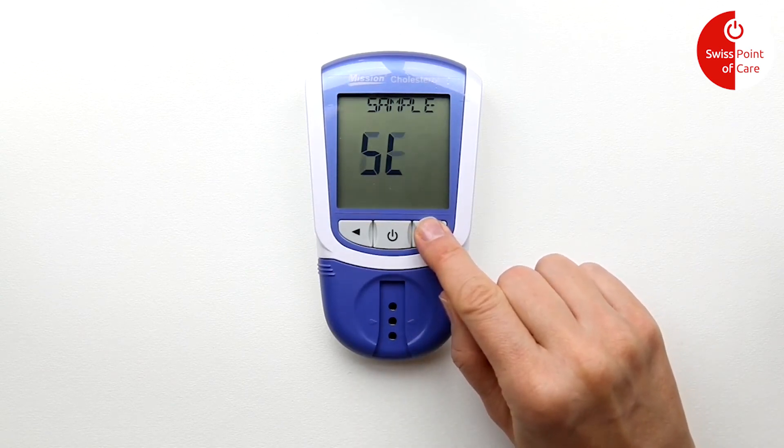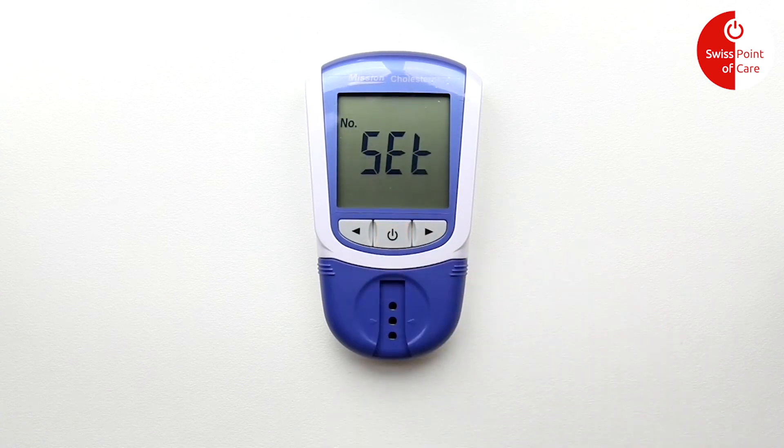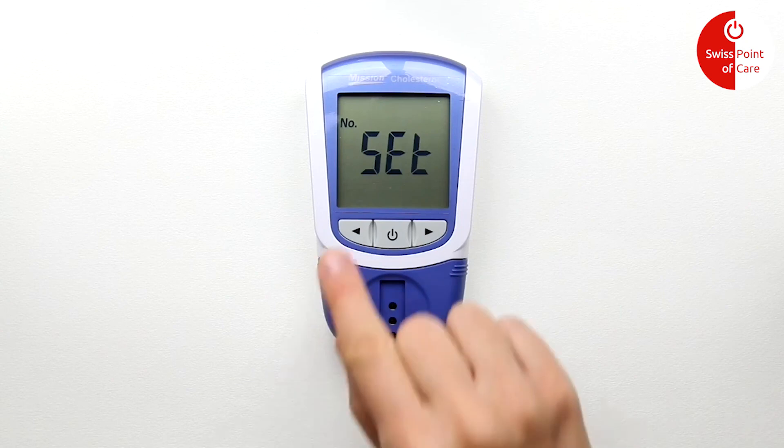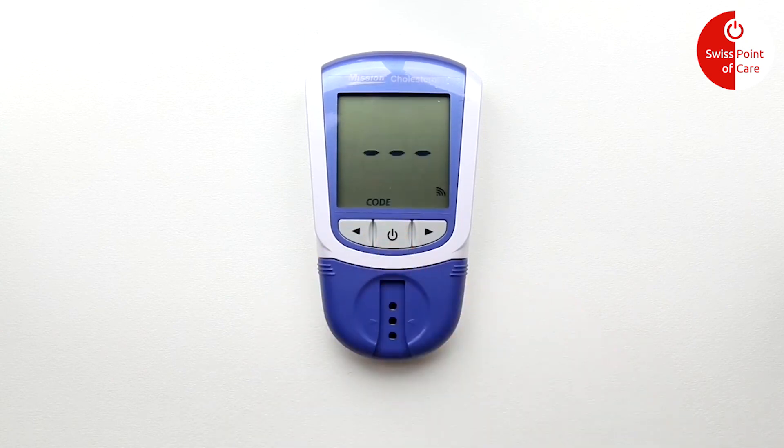Then press the power button again to confirm and continue. Press the left button twice to navigate to ELT, which means exit. The meter is now ready for use.